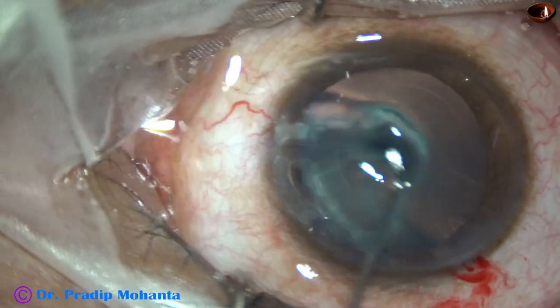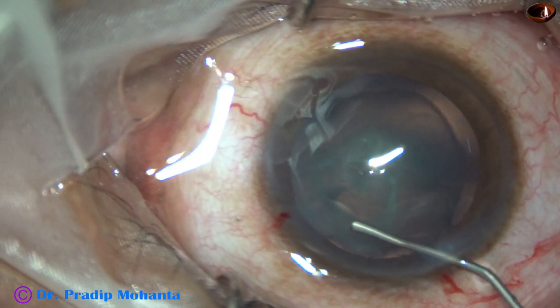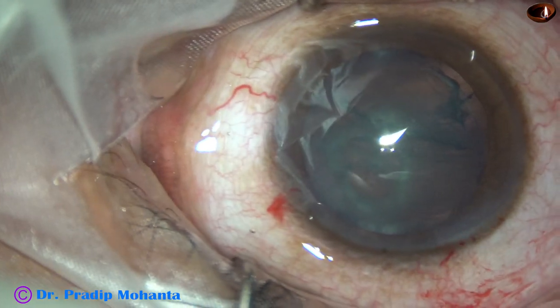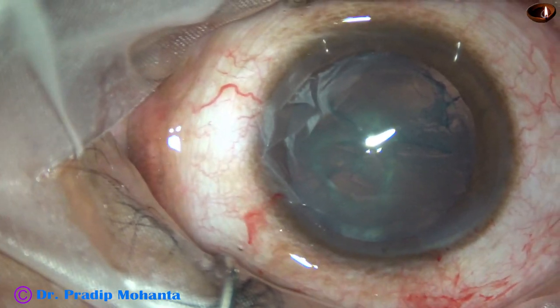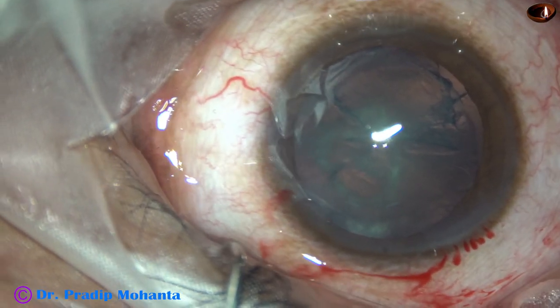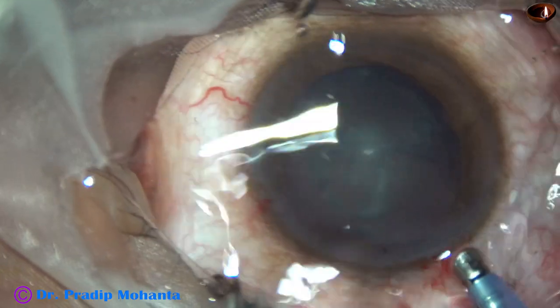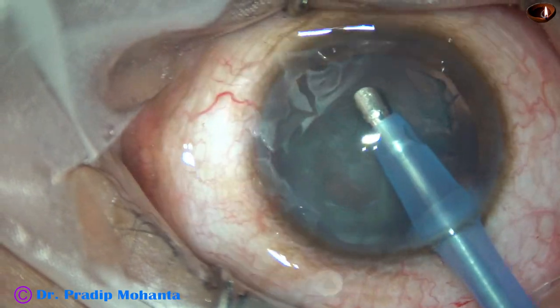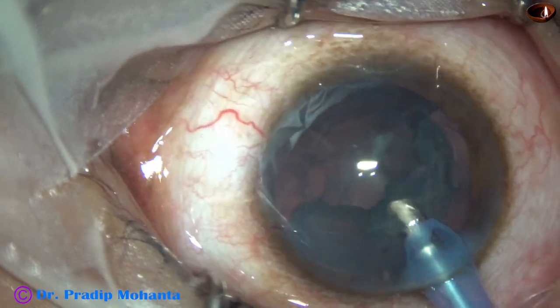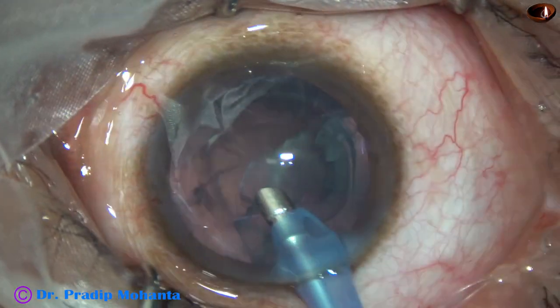And now hydrodissection — very gentle hydrodissection is done. This nucleus is so soft that it doesn't even need pre-chop and cannot be held for chopping. We just have to aspirate the lens mass. As I go to position 2, where I use vacuum in linear mode, most of the lens mass comes out.